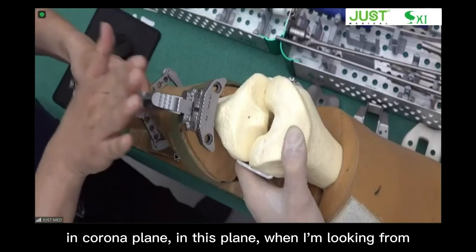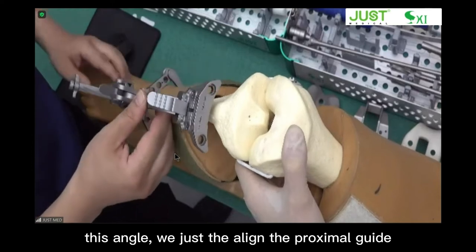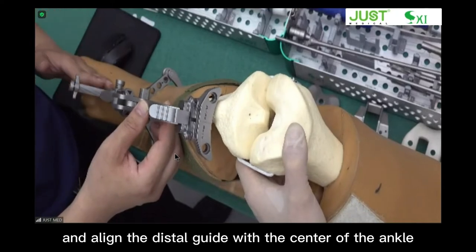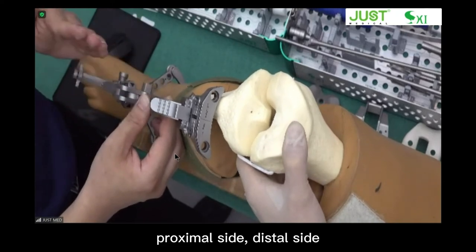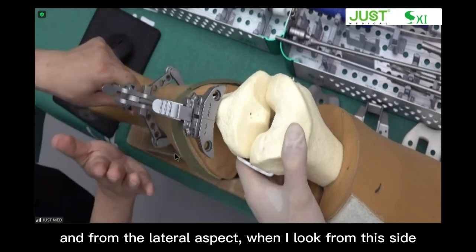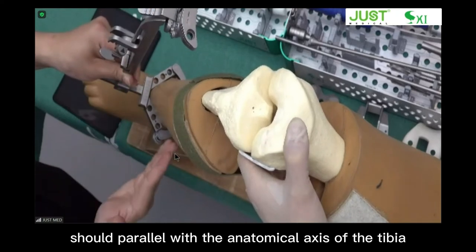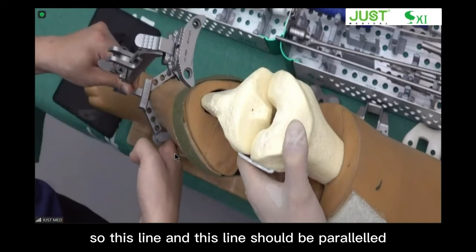In the coronal plane, when I look at the front, this angle, we align the proximal guide with the medial third of the tibial tubercle, and align the distal guide with the center of the ankle, right here. So proximal side, distal side, we choose the proper alignment. And from the lateral aspect, when I look from this side, this rod should be parallel with the anatomical axis of the tibia. So this line should be parallel.